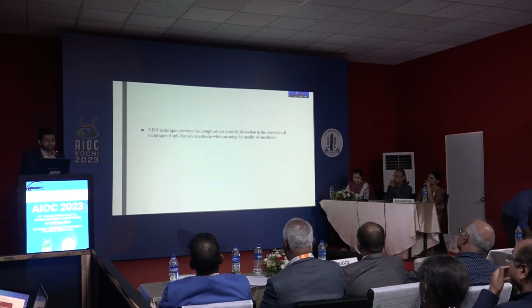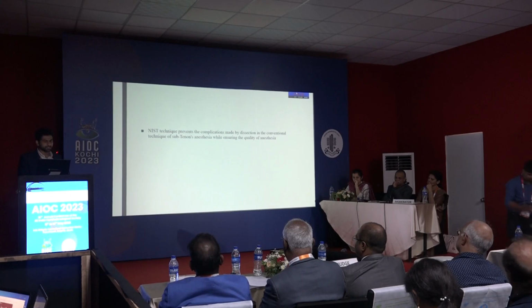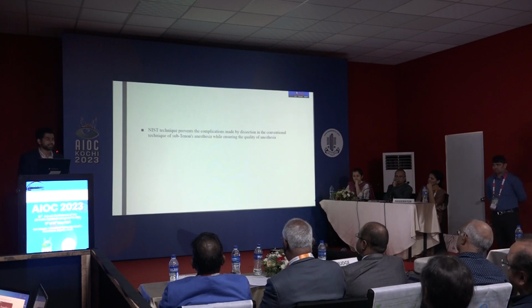So the NIST technique prevents the complications caused by dissection, which is a part of the conventional technique of subtenon's anesthesia, while ensuring the quality of anesthesia. And on post-operative day 1, the patient will have a clean white eye, which is very aesthetically pleasant to the patient. Thank you.